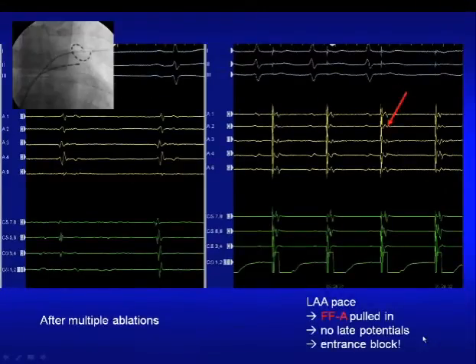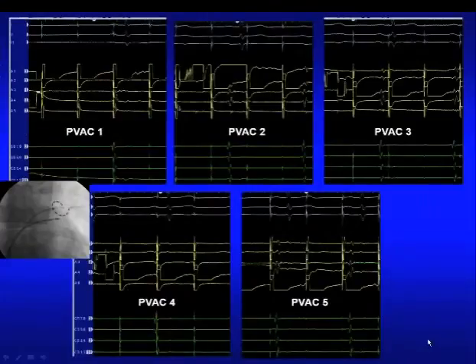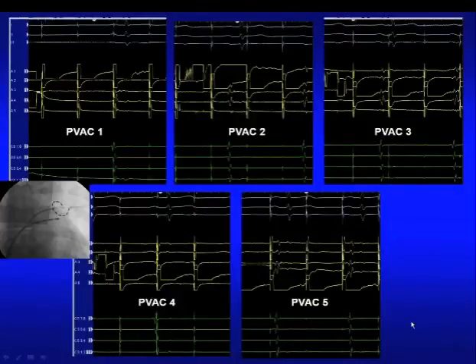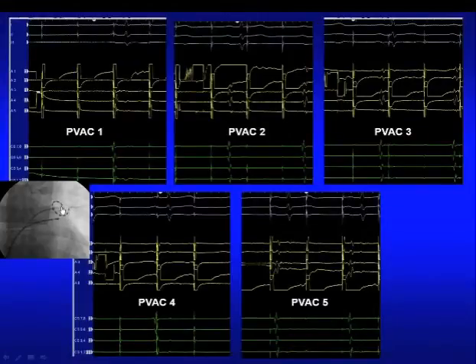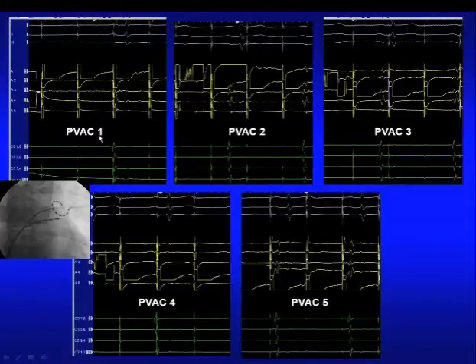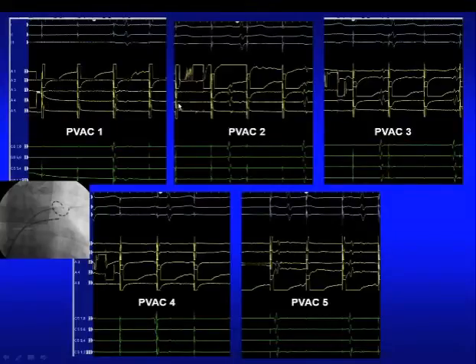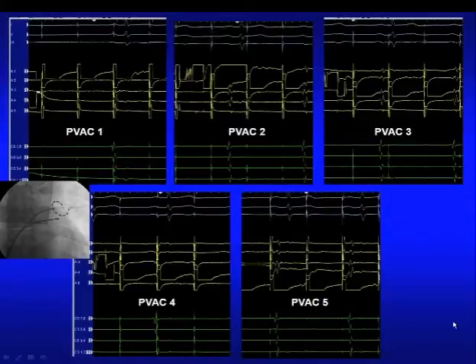With entrance block confirmed as the first step, the second endpoint is validation of exit block. We leave the PVAC inside the pulmonary vein and pace over each PVAC bipole with high output. Pacing the distal bipole — no capture. PVAC 2 — no capture. PVAC 3, 4, 5 — no capture. So what do we do with this?